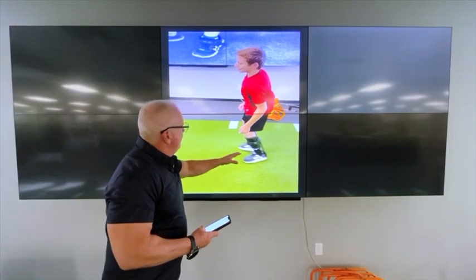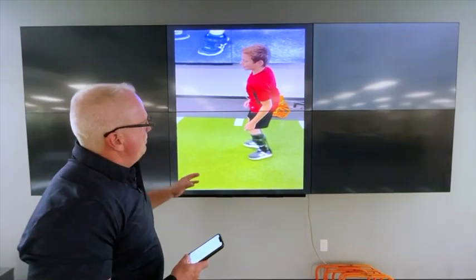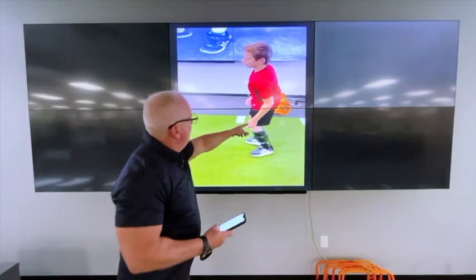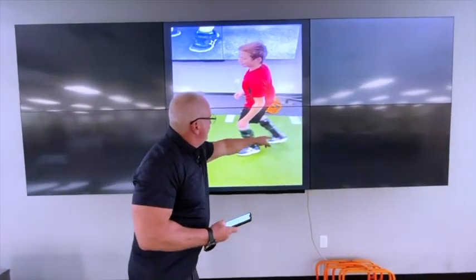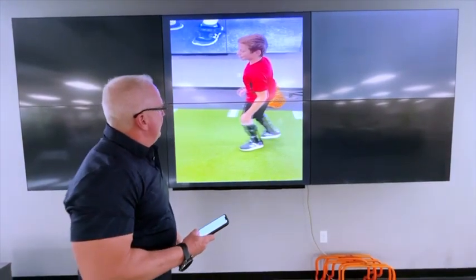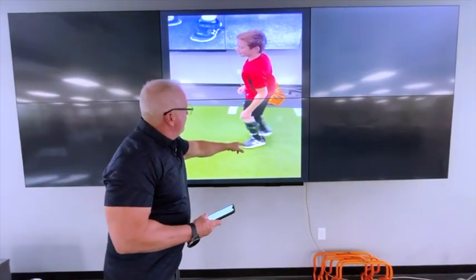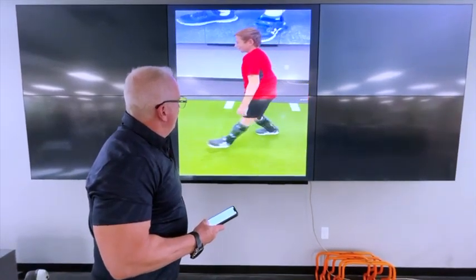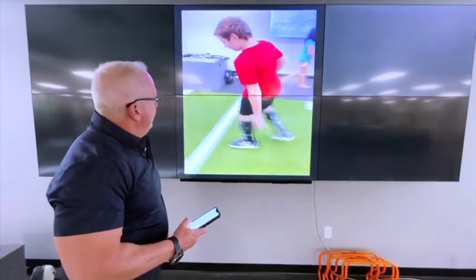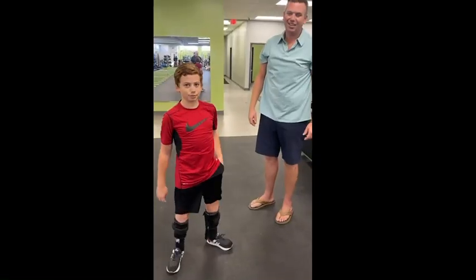And so this is what's happening when he's compensating. Before, his knee would go into a hyperextension moment for stabilization, but because this strut is actually releasing that energy, he's able to stay on the balls of his feet and get that power through without his knee going into extension and hyperextension.